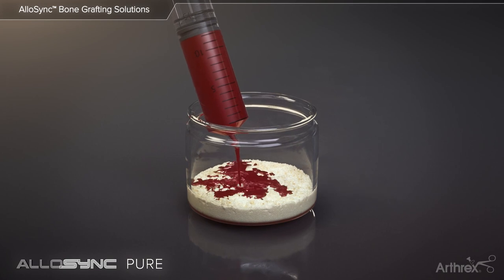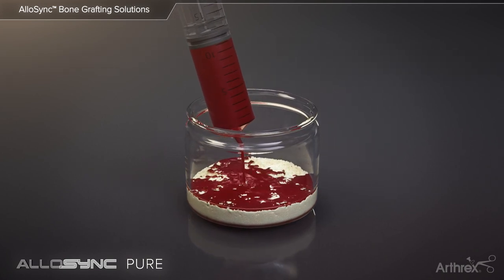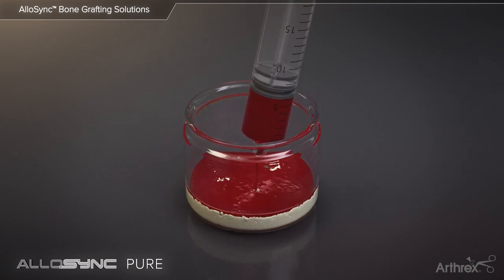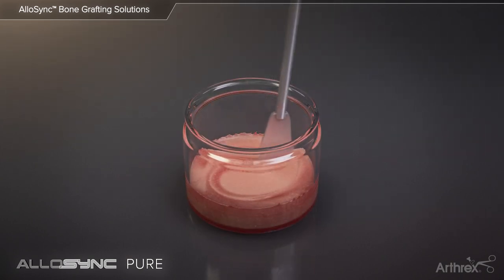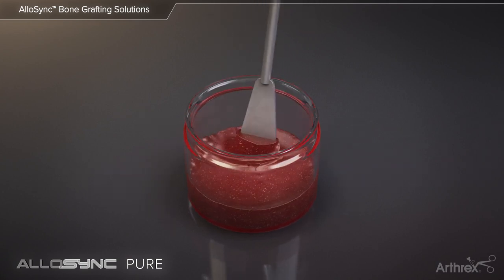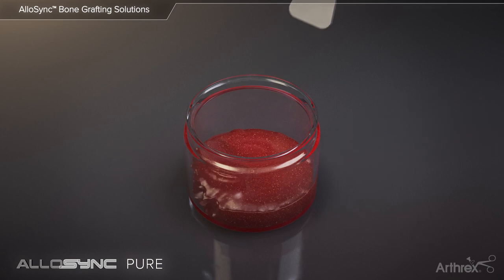Allosync Pure is provided in a ready-to-use mixing jar and may be hydrated with PRP, BMC, or other biologic fluids to create the desired consistency. During preparation, the compression of the graft mixture helps to incorporate the demineralized bone matrix with the bioactive fluid.